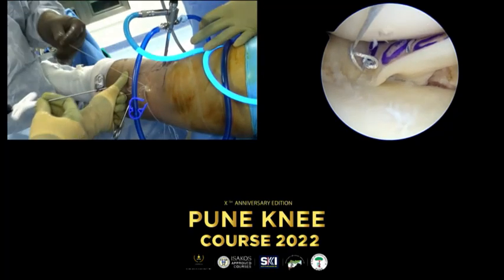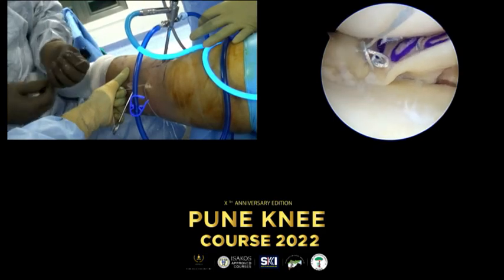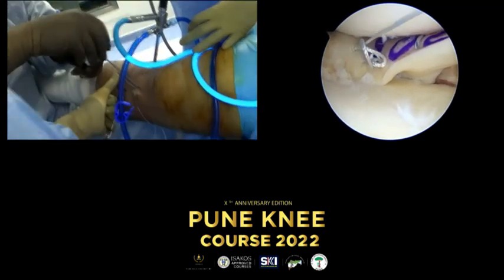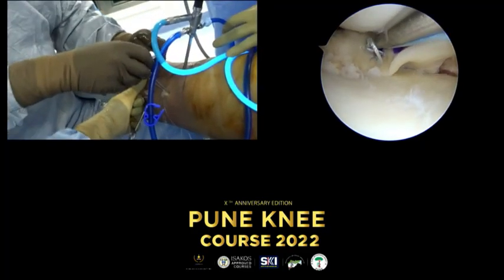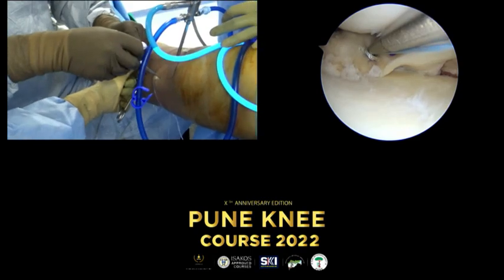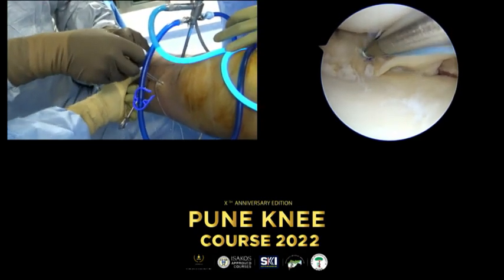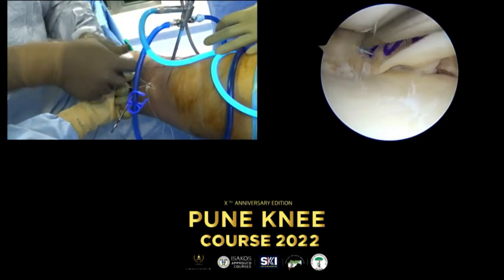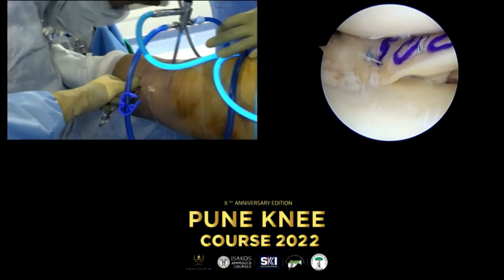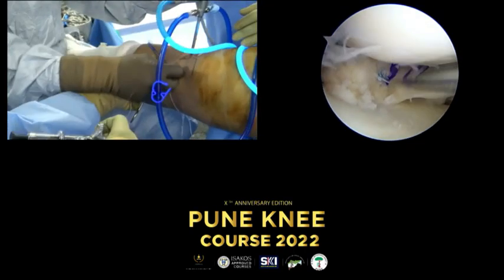Let's see now if I am more skillful. Open more than that. Okay, this works better. Another one. I'm not extremely happy with that one. That's why I'm going to put another one in the posterior horn.